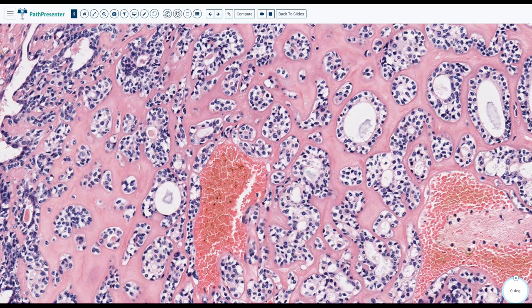Okay. All right. It kind of changes, and it's basically kind of philosophical, so you won't want to go there. All right. So this is epithelial myoepithelial carcinoma. Okay. Epithelial myoepithelial carcinoma.